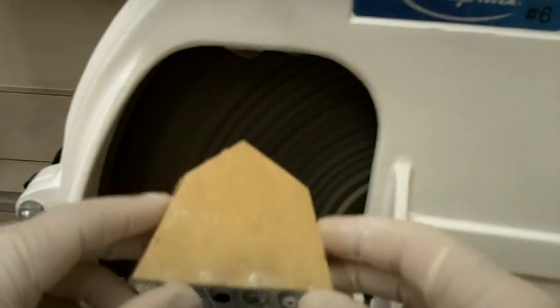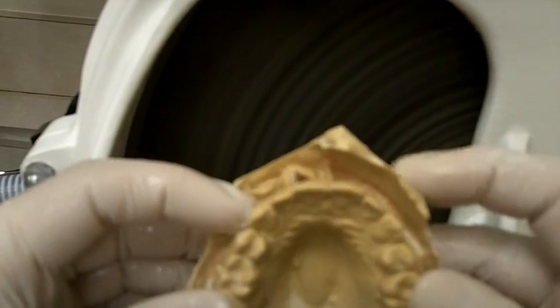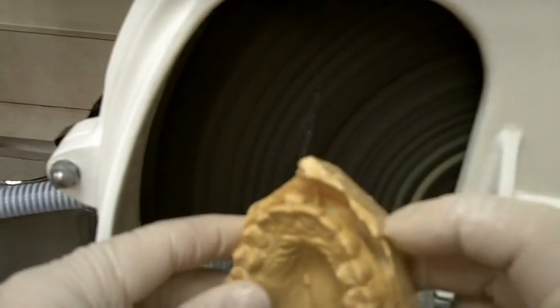See how the water's pooling? You want to make sure that you take the cap out so that the water is able to go down the drain and not flood all the way out, okay? So you can see it's starting to take shape. It's canine to canine to canine. Canine, this one needs a little bit more.